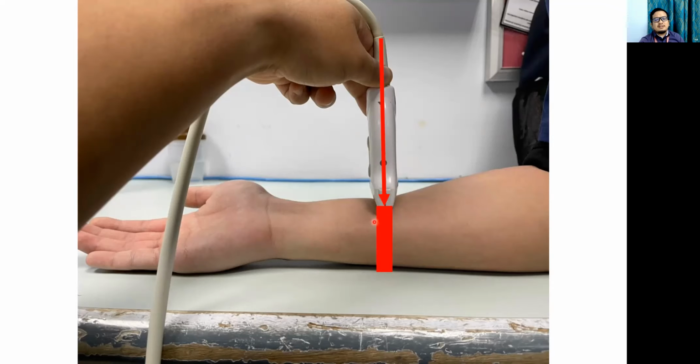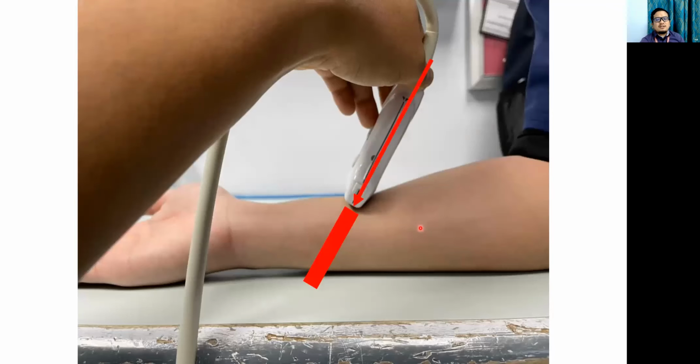It will not show the other parts here and here. Likewise, if you put the probe obliquely, tilting or fanning like this, the block and slice of images will be sent to you in this direction.